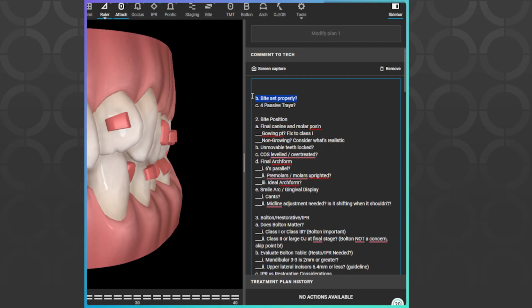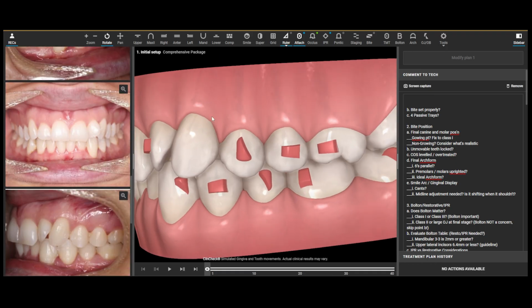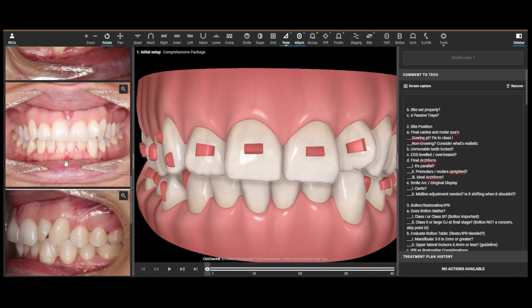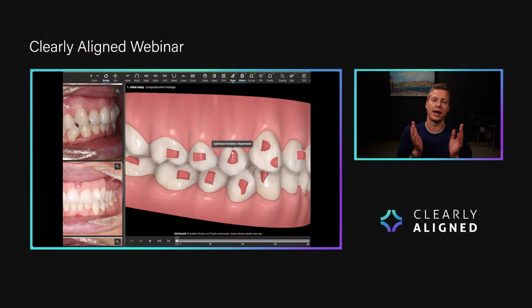The next thing would be, is the bite set properly? So if we click to our records, we can now compare what does the occlusion look like from the side. Are the teeth in the same spot in the photos as what you see on the ClinCheck? Or is the patient biting with like a functional shift? Again, where this was relevant is the other day when I was checking one of my assistants' scan, you kind of see the classic, like it's brand new patient and the patient's biting right edge to edge. None of their back teeth are touching.